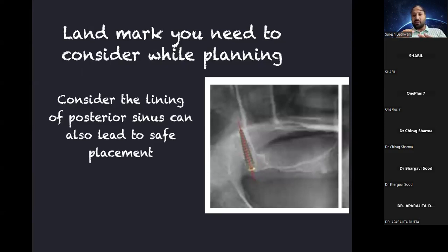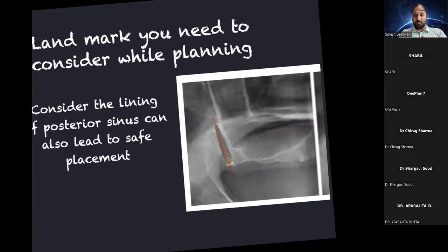Now this is something which we have placed, but how prosthetically it will be viable is something which we need to understand.